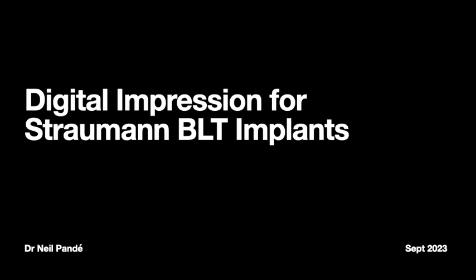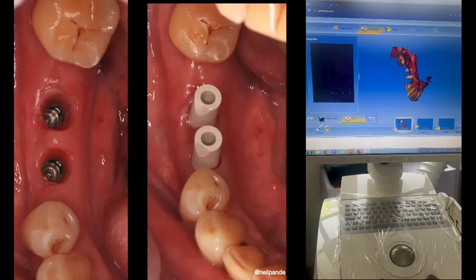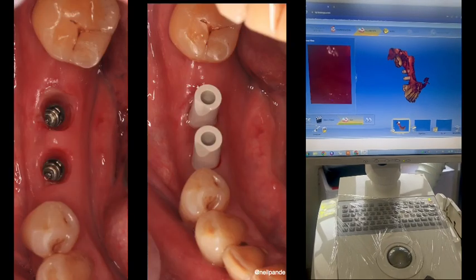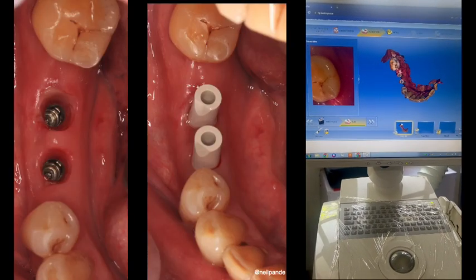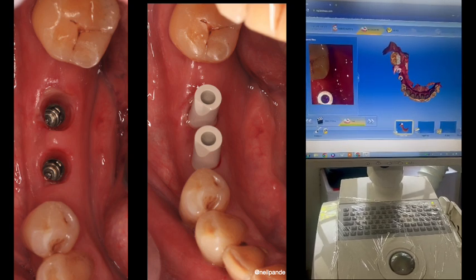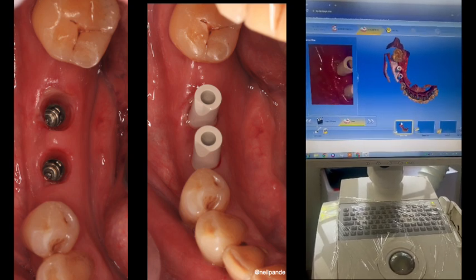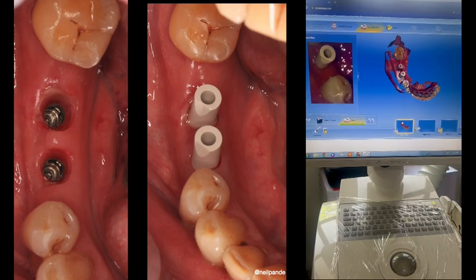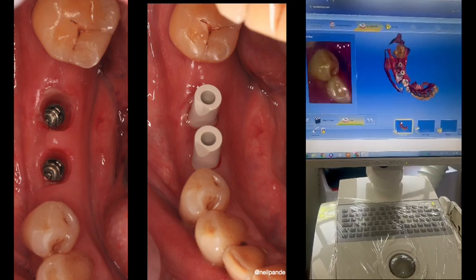Hello everyone. Today I'm talking about digital impressions for Straumann BLT implants. It's very easy once you have a scan post like this, which is a mono care scan body, which you stick onto the implant and then scan it.